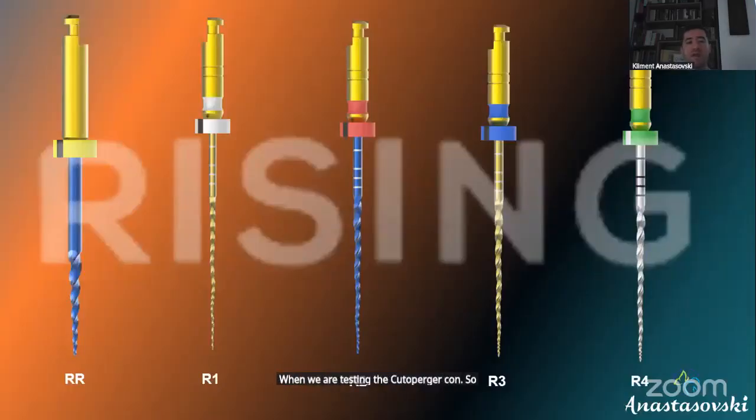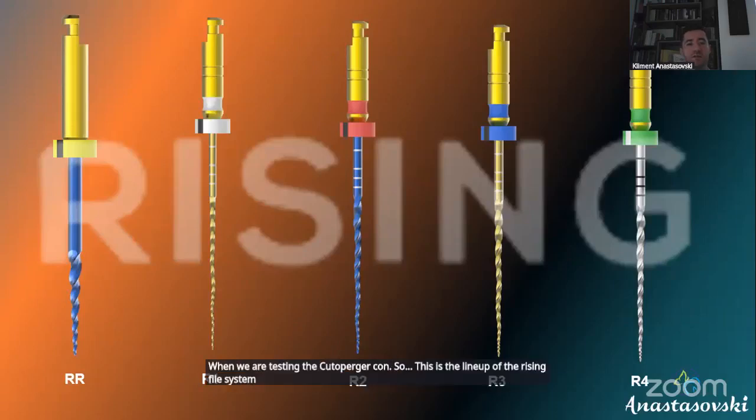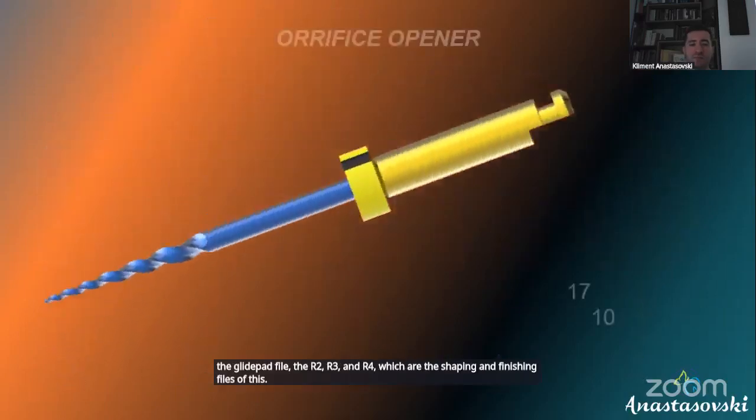So this is the lineup of the Rising file system. We have the orifice opener file marked as RR. Then we have the R1, the glide path file, and the R2, R3, and R4, which are the shaping and finishing files of this rotary system.